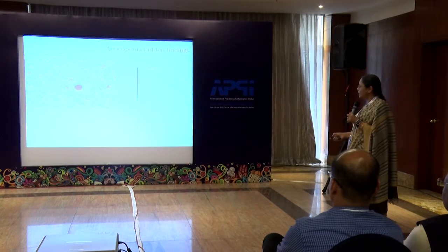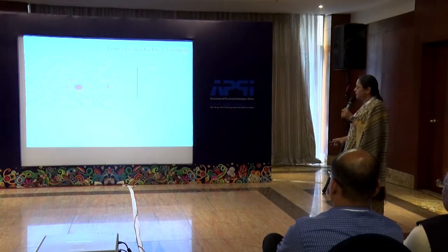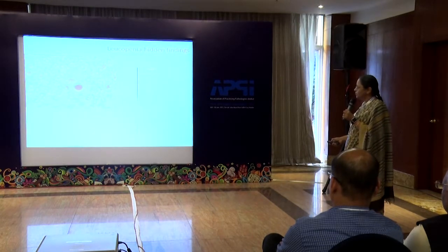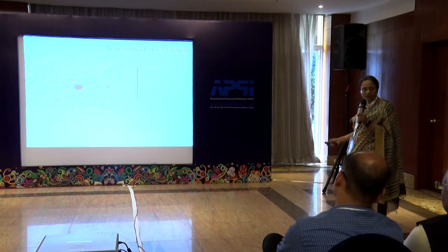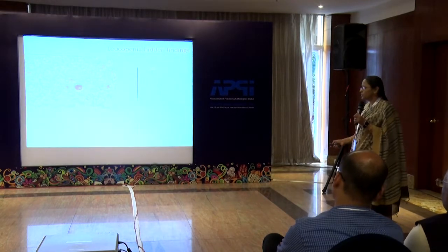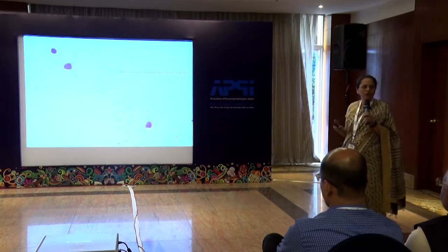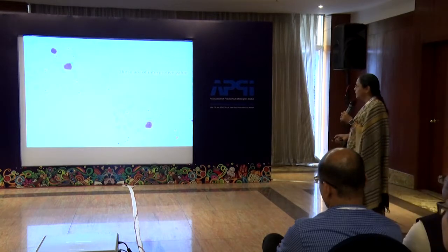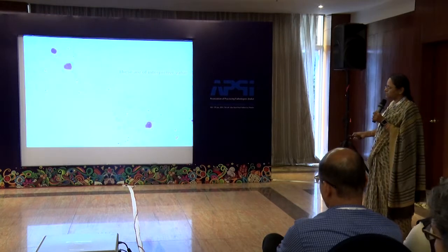Another leukopenia, and this cell, again, I'm afraid maybe the people at the back will miss, but this shows fine projections. Leukopenia, thrombocytopenia, and this is an agranulocyte, a lymphoid cell with hairy projections. So another classical finding, which will be missed if you depend only on your 3-part or 5-part differential counter.